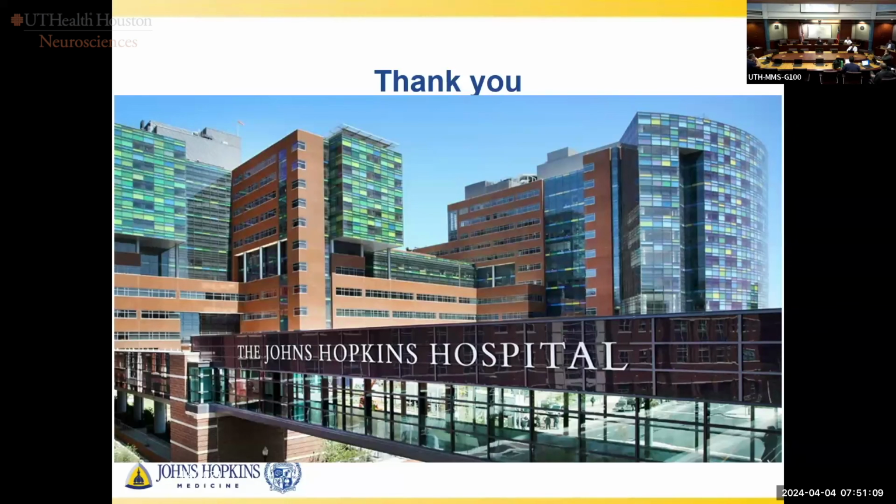And so for me, at least right now, and you may be right, in 10 years the robots may be so good in the AI they make us obsolete. But right now, I love having the tactile feedback when I'm using the AR and I'm actually putting the screw in. I can tell if it's going in the right place or not. And sometimes it doesn't because of skiving, which happens with any of these systems.